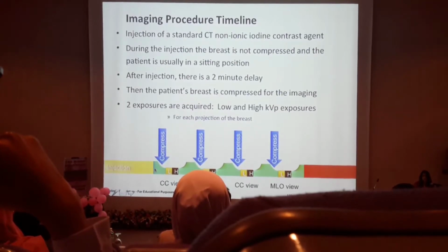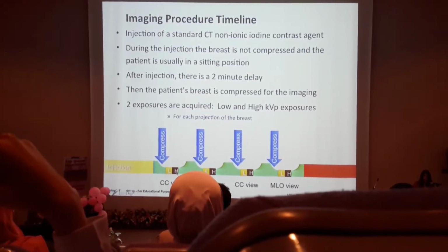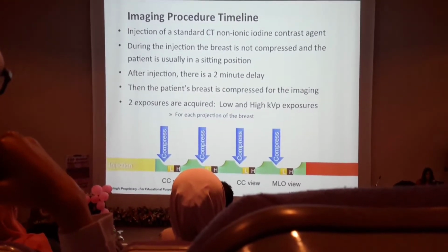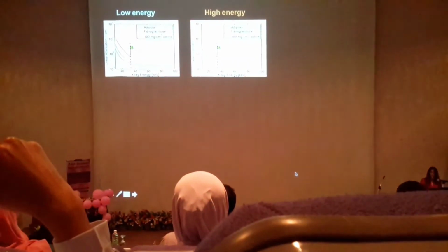So we do the same for standard mammographic views. At each view, just now I had mentioned about low and high energy, at each view a low and high energy image is taken in rapid sequence. So we do the 4 standard views, and these are the images that we will obtain.